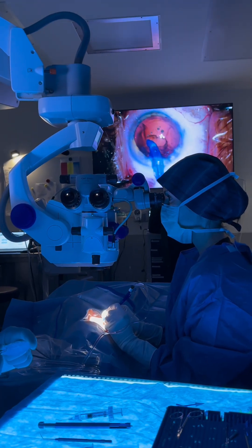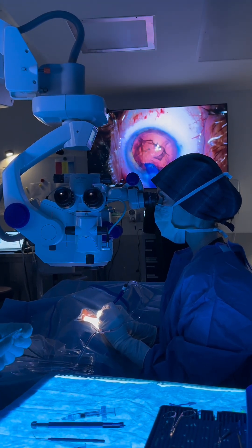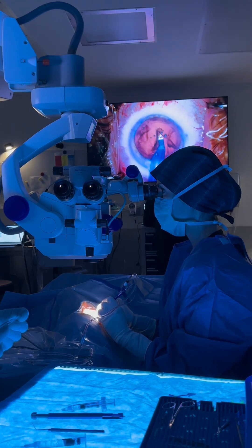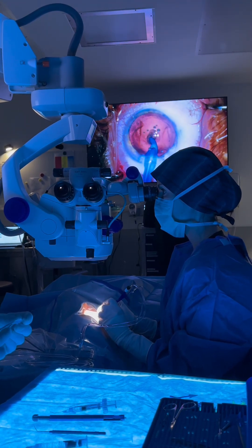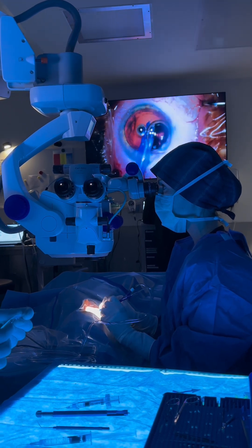What I try to teach our trainees is to be what we call efficient with your movements. Every movement inside the eye serves a very specific purpose because the structures are so small and so delicate. You really want to be efficient with your movements.